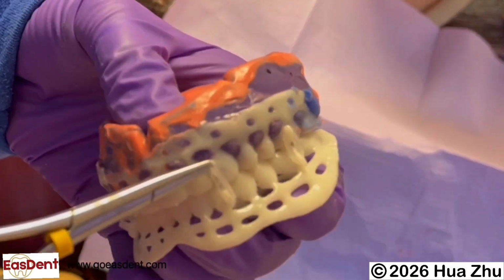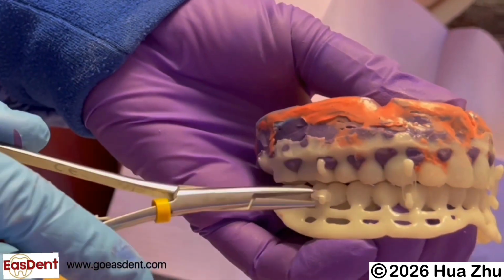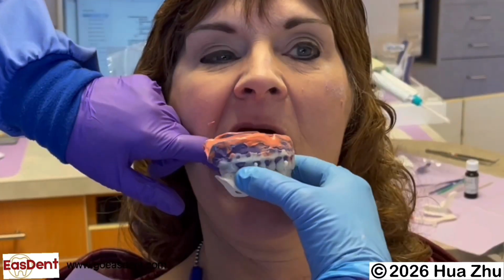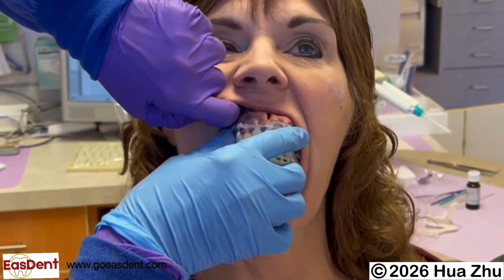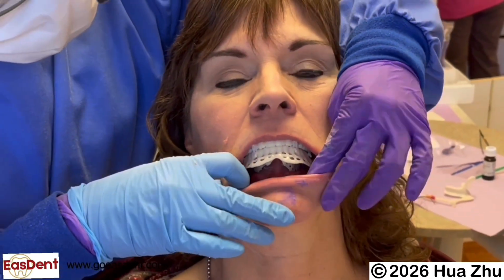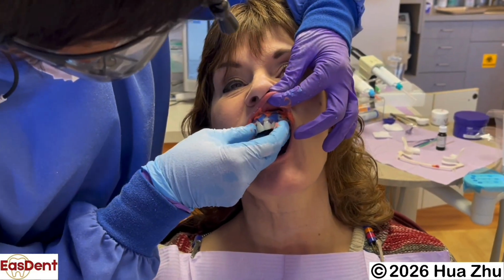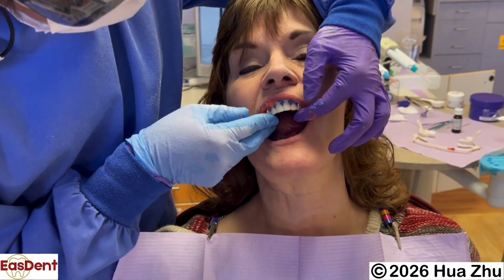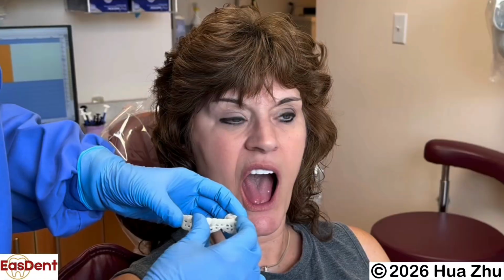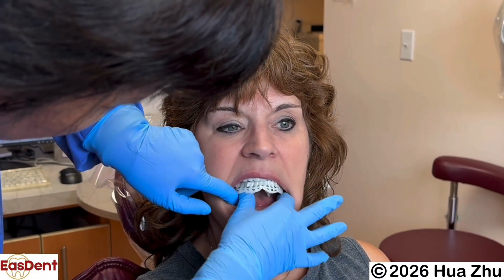If the patient's mouth can open wide to fit both maxillary and mandibular trays in at the same time, put elastomers on the buccal hooks to hold the maxillary Easdent impression with the mandibular Easdent tray together and put them in the mouth together. If the patient's mouth cannot open large enough, put maxillary Easdent impression in first, then mandibular Easdent tray, align the teeth.